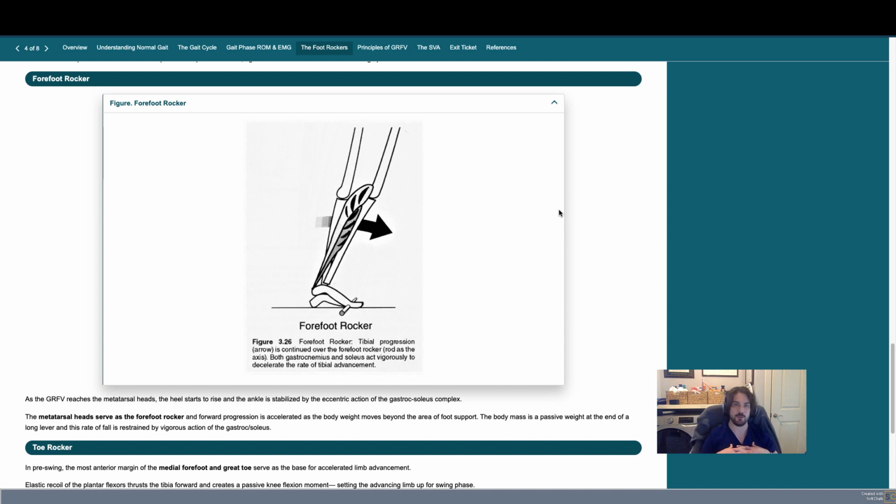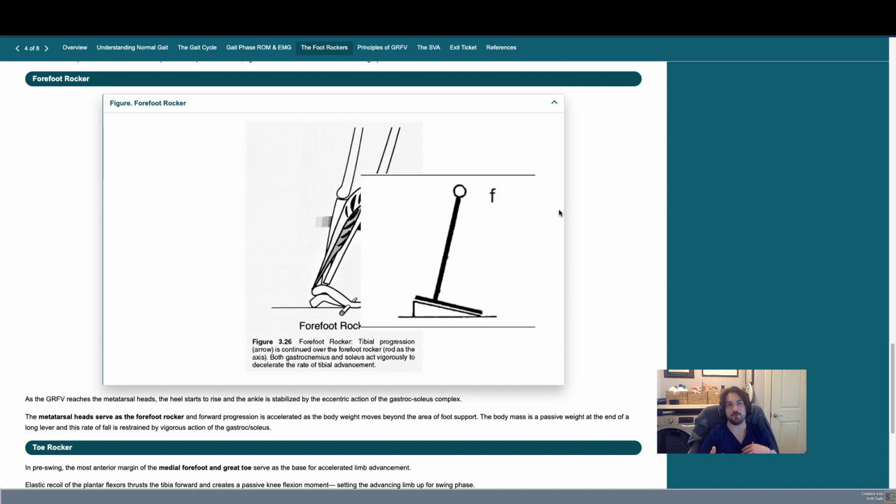So the first thing that we can do is we can add a heel wedge to our AFO side to promote more of an inclined tibial angle, or an inclined shank angle, to where we have that 10 to 12 degrees of tibial incline during mid-stance.